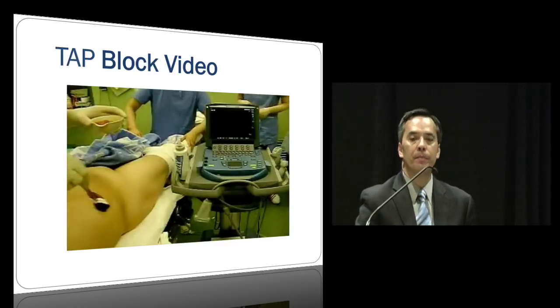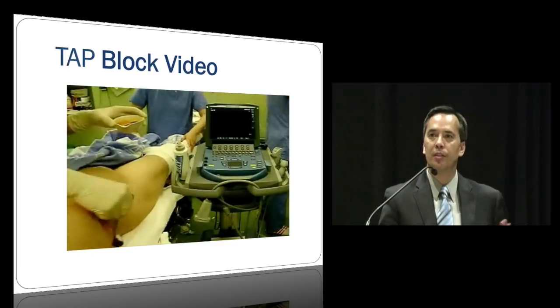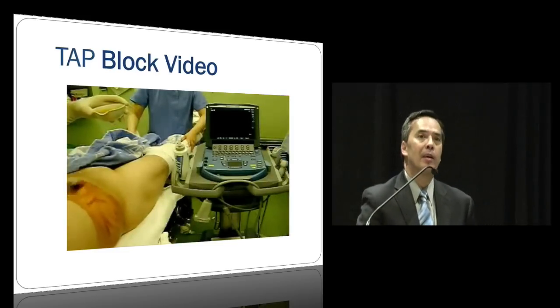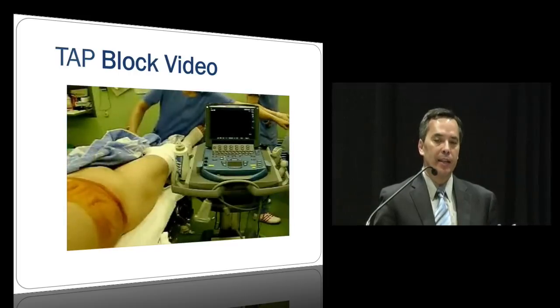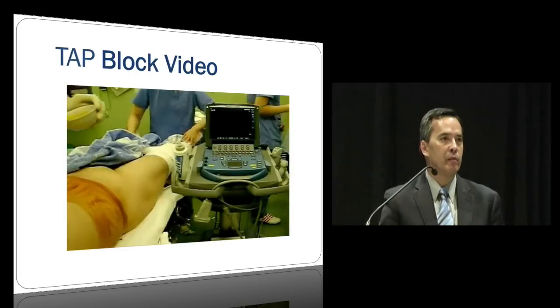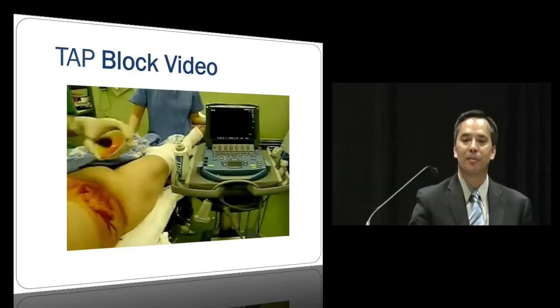Okay, here's the video. So just like Dr. Charest said, you can just come here and see the video for sure. And this is sort of cumbersome. You can see that it takes a long time. So first you have to put betadine down. You have to get everything ready. There's a lot of people standing around, sort of like government work, a lot of people standing off to the side. And you'll see that later.